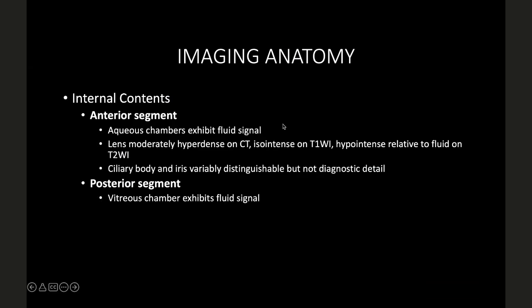So in fluid, CSF is going to look dark on T1 and bright on T2. So aqueous humor is going to follow the same signal. Density-wise on a CT, it's going to look like CSF, which is hypodense. The lens is moderately hyperdense on CT, but it can change its intensity on MR. It's isointense on T1 and hypointense to fluid on T2.